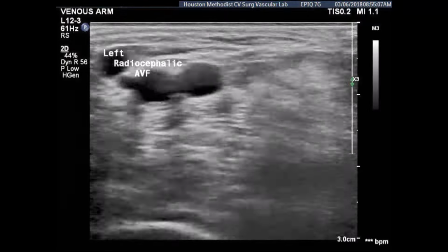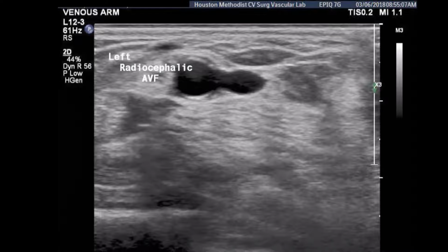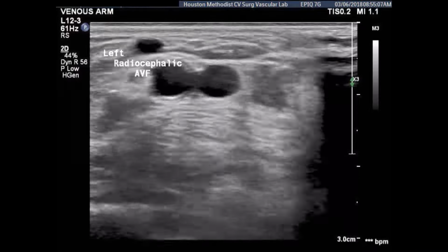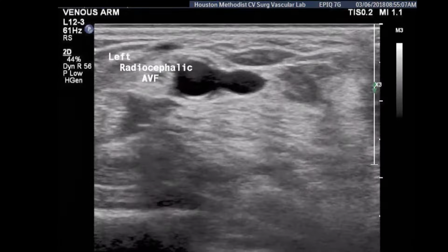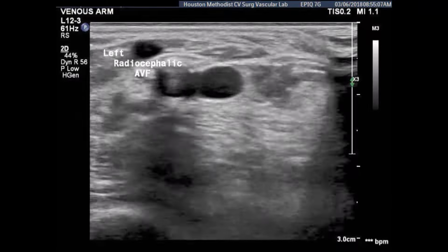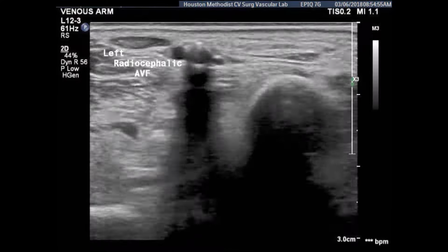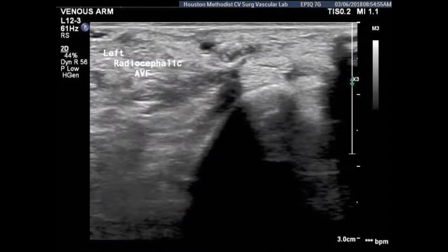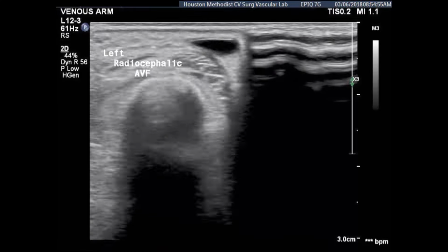You will have a feeling that this is how we started this lecture. This is going to be that stenosis problem. So this is where having the cross section first is crazy helpful, right? Yes. If you went back to your first one, what I noticed was there's a lot of calcium in the arterial system, right? That's one thing. When you looked at the area around the anastomosis, it almost looked like there might be something within the arterial lumen, and it could just be shadowing from the calcium.